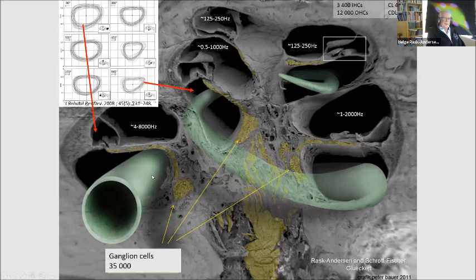And you see the most basal region now is here, 4-8 kilohertz, and we have a pretty large scala tympani which narrows only after 1¼ of a turn. You can see how it becomes pear-shaped, and it's much smaller, which explains why sometimes you get some resistance when you insert your electrode after one turn.